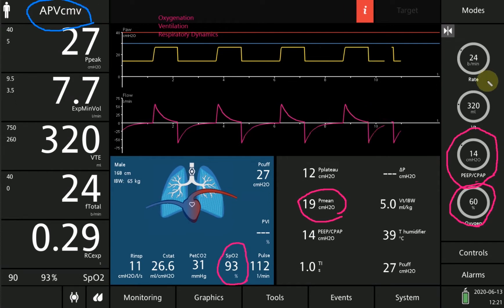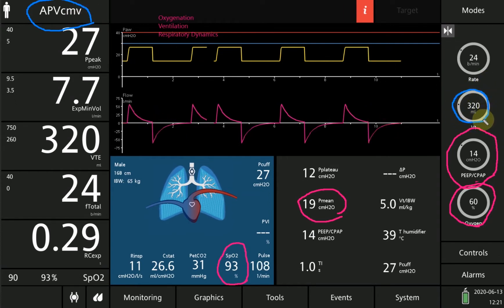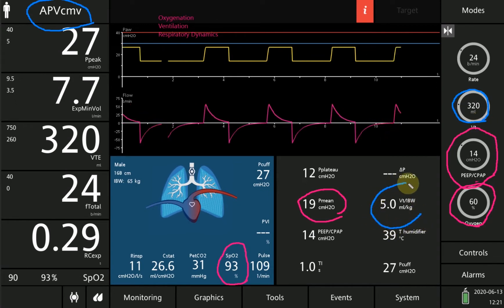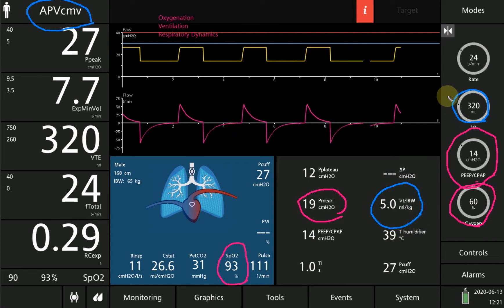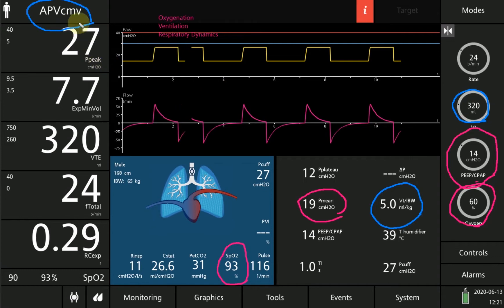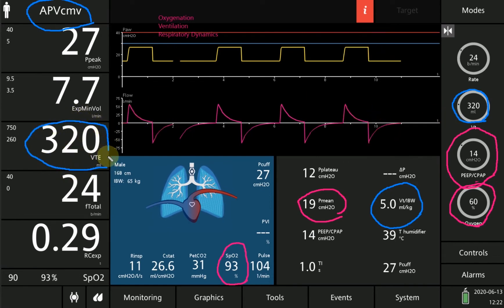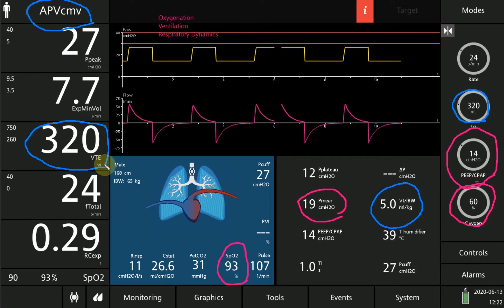In this mode, we set the tidal volume at 320 ml, which gives the patient 5 ml per kg based on his ideal body weight. This is a targeted tidal volume, and the pressure is regulated up and down to achieve it. You can see this tidal volume is achieved at an expiratory tidal volume of 320 ml.